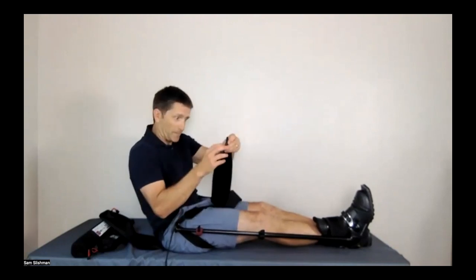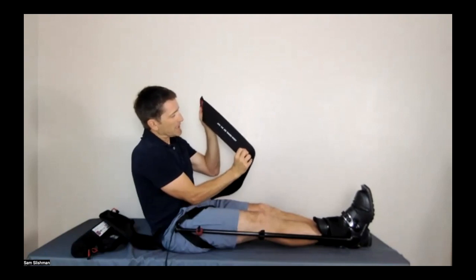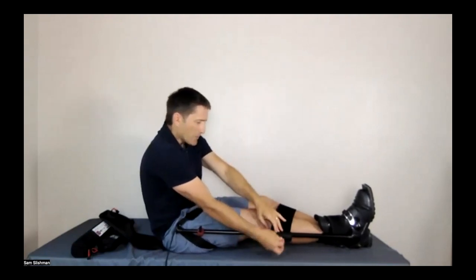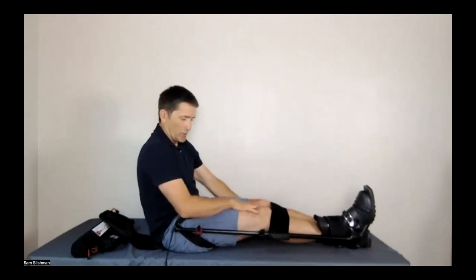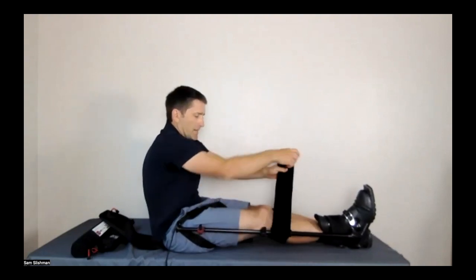There's a mid-leg strap as well. This says apply this side towards patient, so set it here. I prefer to apply this distal to the knee, just so that you can see the full line, and then wrap around. And so now I have traction plus rotational stability.